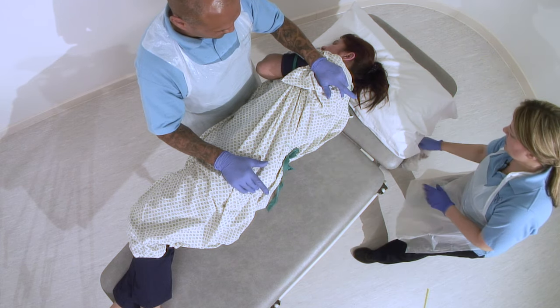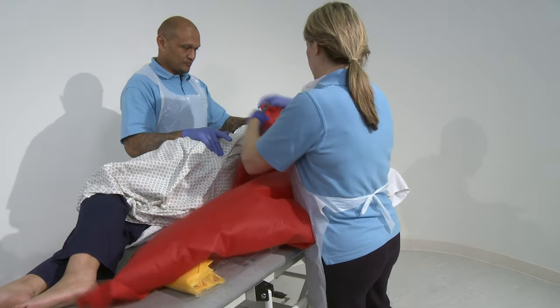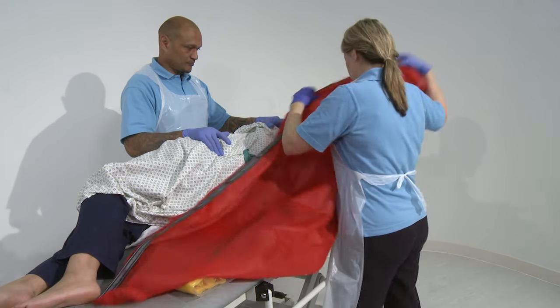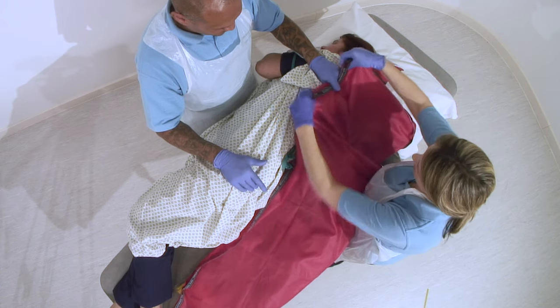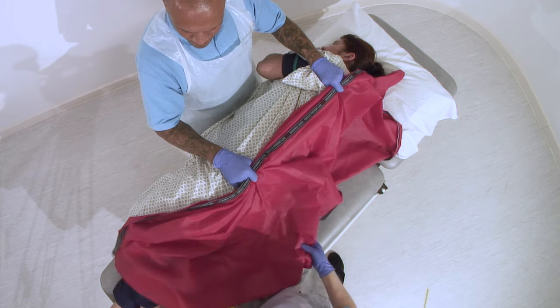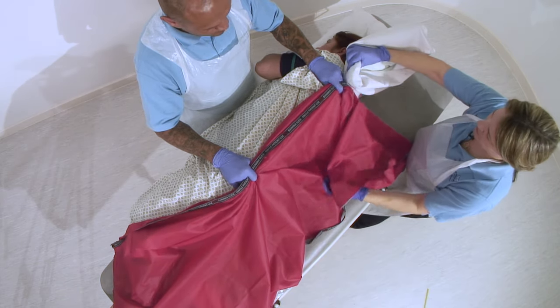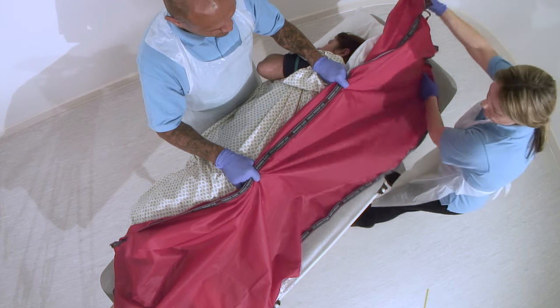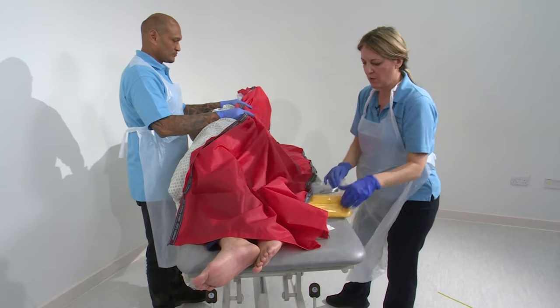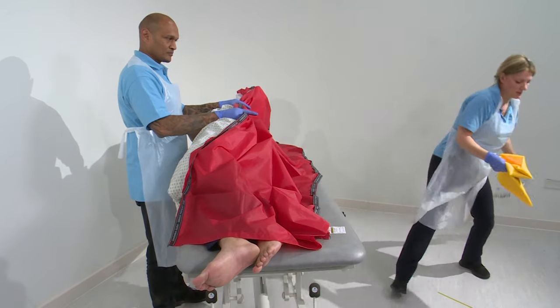Now I can get my slide sheets out. What we need to have is the red one against the patient. I'm going to tuck that up underneath that finger, tuck that up underneath that finger and just spread it out. The beauty of these slide sheets — let's just take the pillow up as well please Rob — they reach the full length of the bed and the patient will stay on them. The second slide sheet needs to go against the bed.